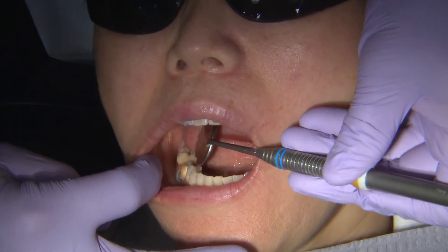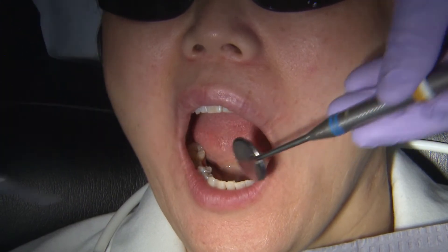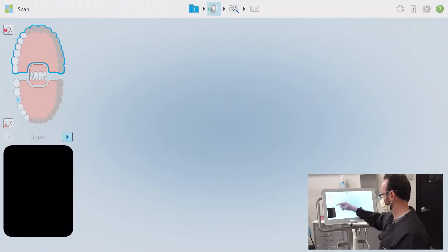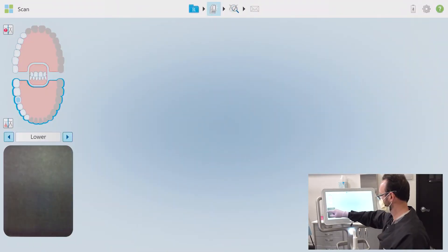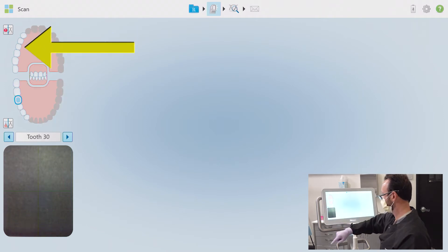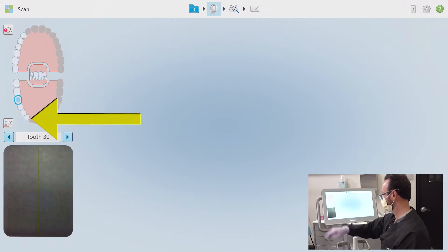At this point I'm taking out the lip and cheek retractor that's already been put in place. This is a personal preference of mine and you may want to experiment with scanning both ways; however, I've found that if I minimize foreign objects in the mouth while scanning, my comfort level increases and the outcome is better quality. For these posterior molars, only a quadrant scan is required and the teeth suggested to be included in the scan are highlighted in white on the chart model — these highlighted teeth are merely suggestions.